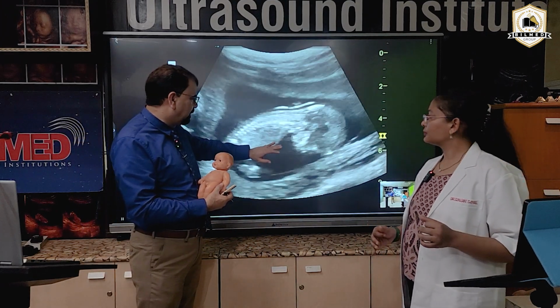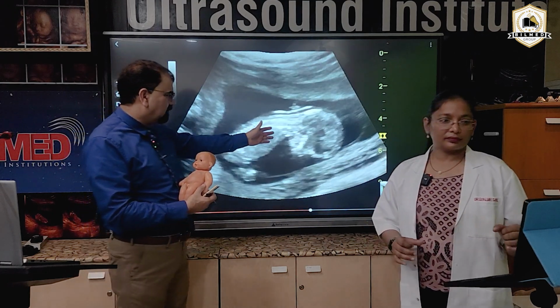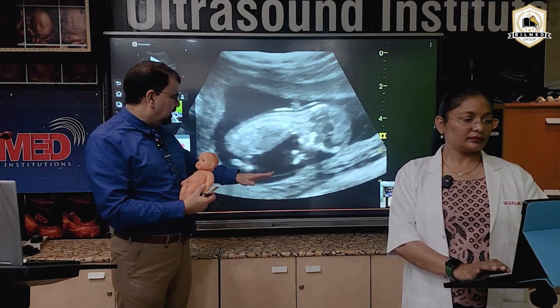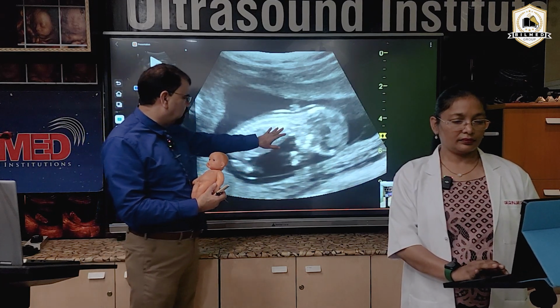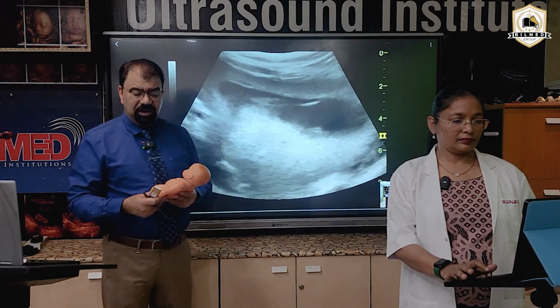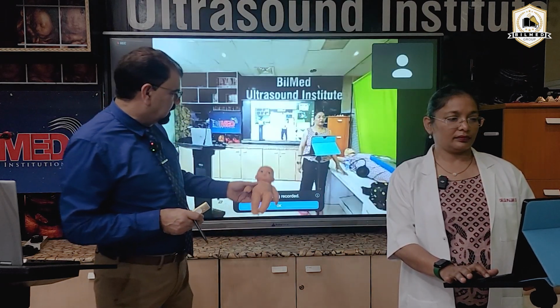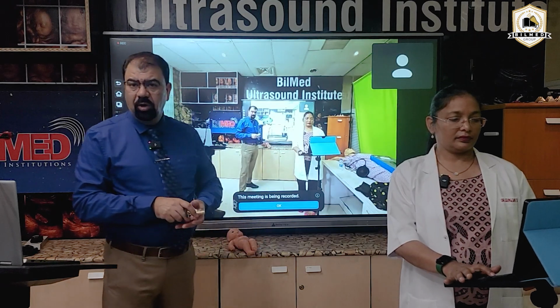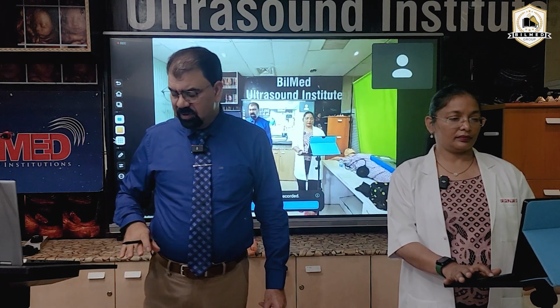And it will not always be a static image because the fetus is moving here and there. You have to be very patient. So this is the complete mid-sagittal section which you have to look for when you are taking the level 1 scan. This is also the section where you take the crown rump length.